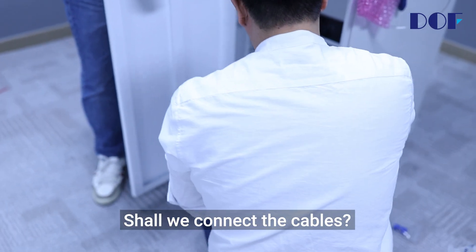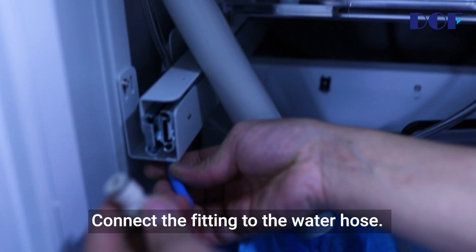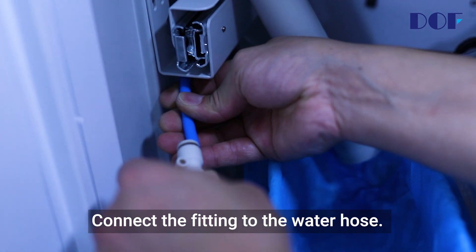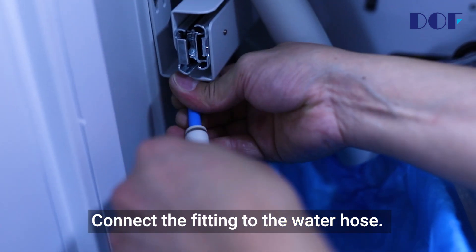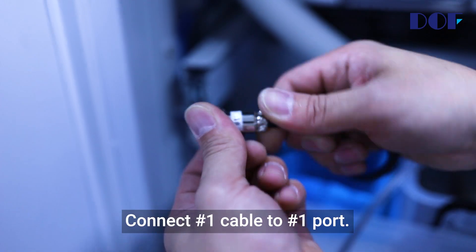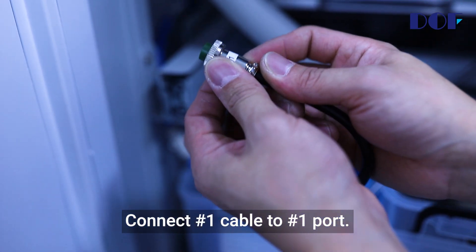Now let's connect the cables. Connect the fitting to the water hose and push it all the way in. Connect number one cable to number one port.